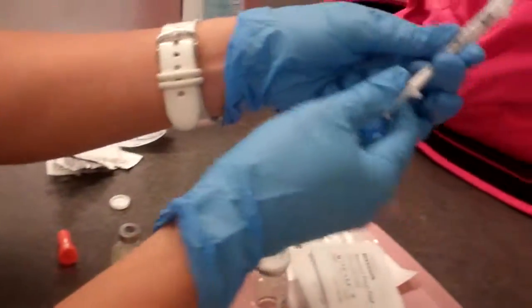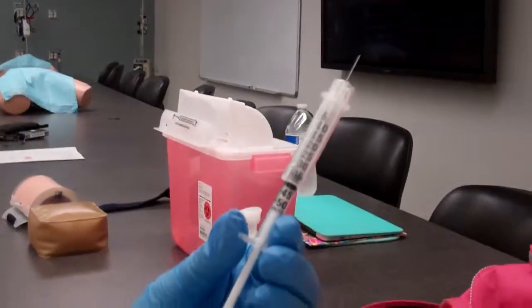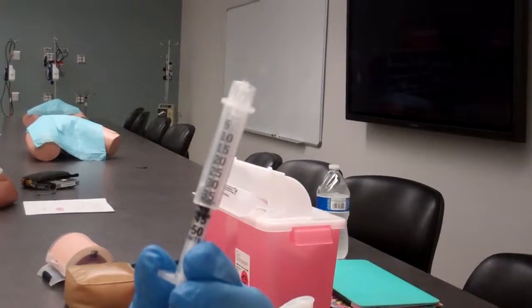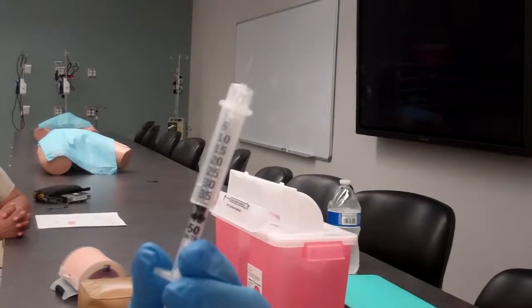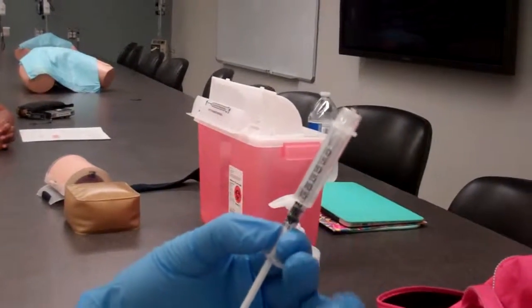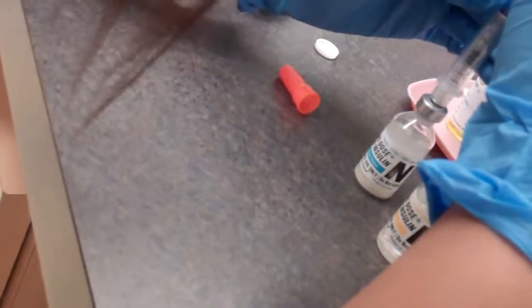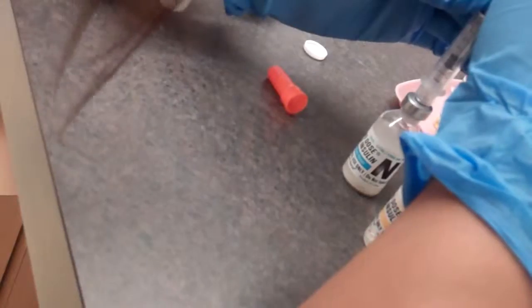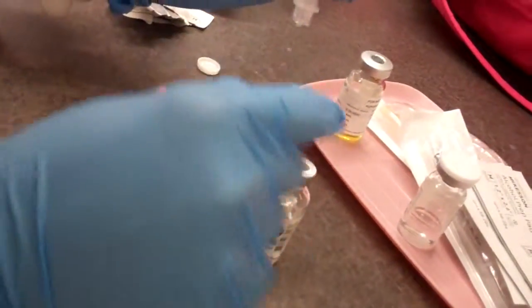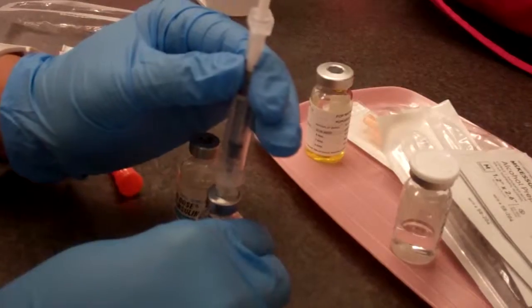Okay. So I need 35 for my NPH, and then I need to add 8. So 1, 2, 3, 4, 5, 8 for the regular, so it's a total of 43. I'm going to inject in the cloudy first. 10, 9, 8. And now I'm going to inject the rest into my regular.